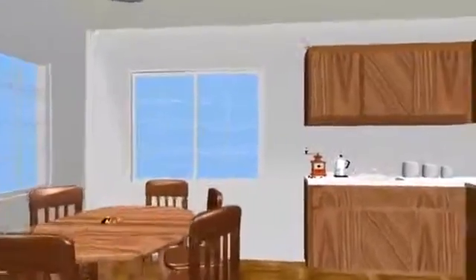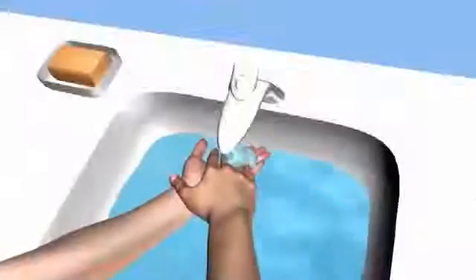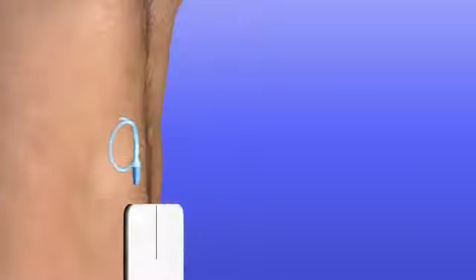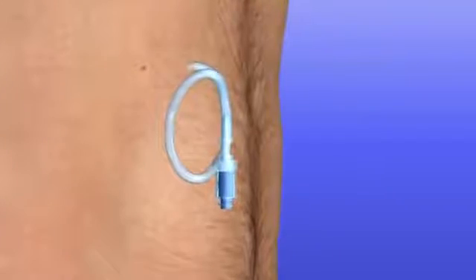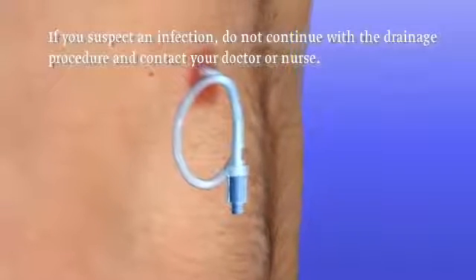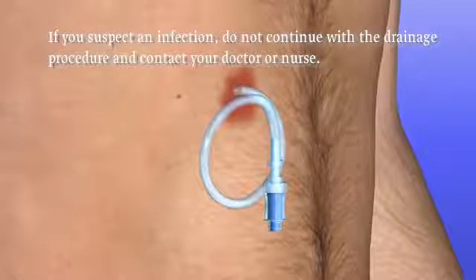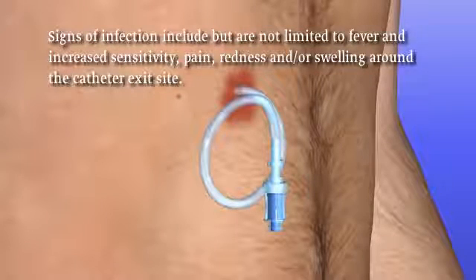Prepare for the drainage procedure. Locate a clean and uncluttered workspace to perform the drainage. Wash your hands with soap and water for at least 1 minute. Remove the adhesive dressing, gauze pads, and foam catheter pad from over your catheter. Check for any redness, tenderness, swelling, or fluid around the catheter. If you suspect an infection, do not continue with the drainage procedure and contact your doctor or nurse. Signs of infection include, but are not limited to, fever and increased sensitivity, pain, redness, and/or swelling around the catheter exit site.